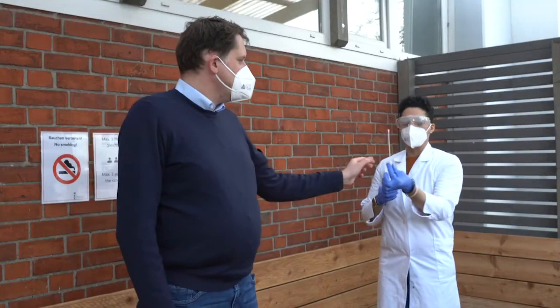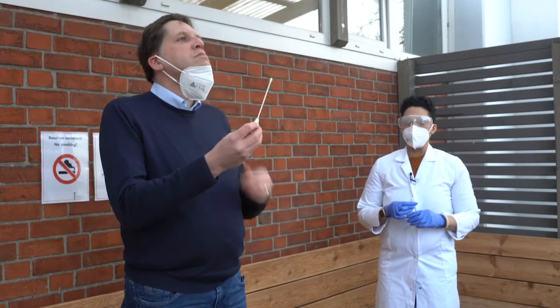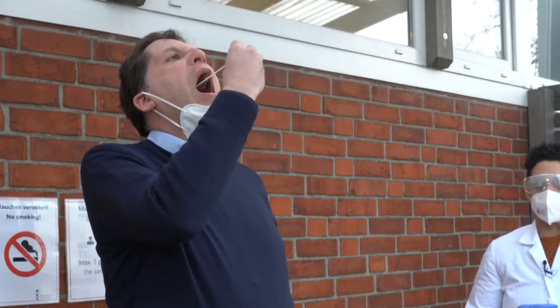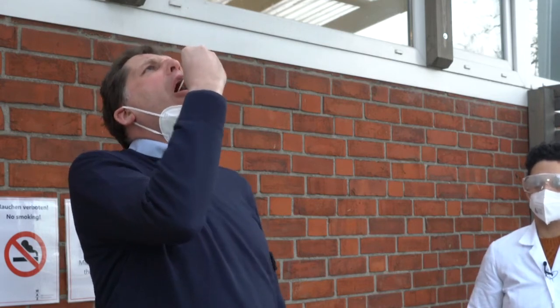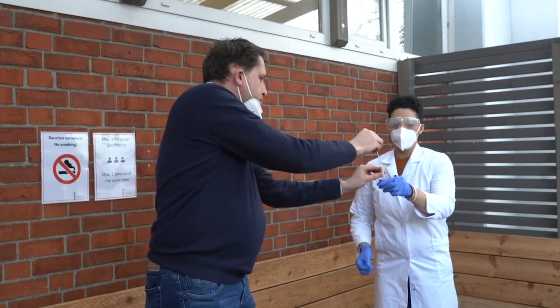So the PCR set looks like this, you're going to crack it open, give it back to your proband. He's going to have to put the nasal mouth protection down, lean his head back again, and put it all the way down his throat, all the way in to the point that you're going to gag. It's a little uncomfortable, it's okay. Thank you very much. Put it back in the tube.